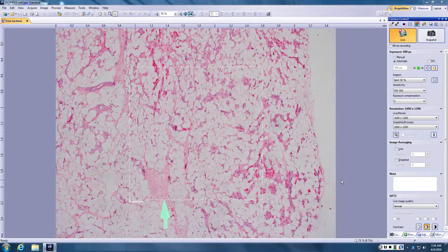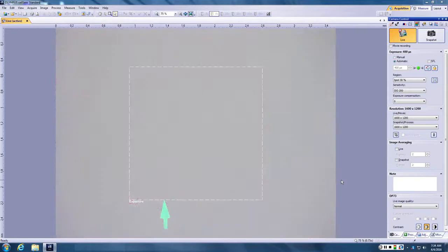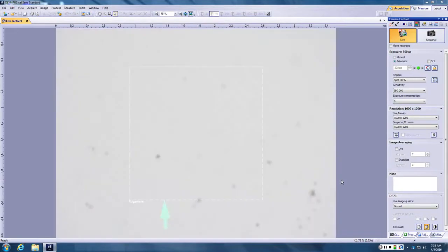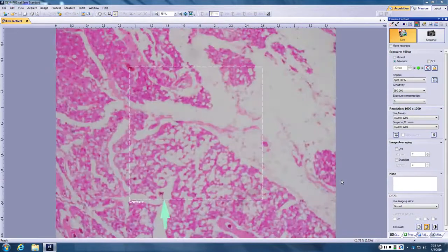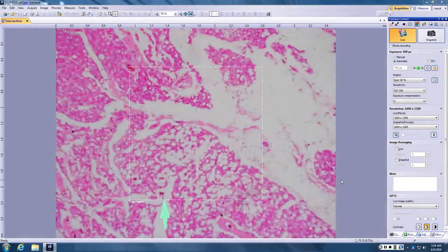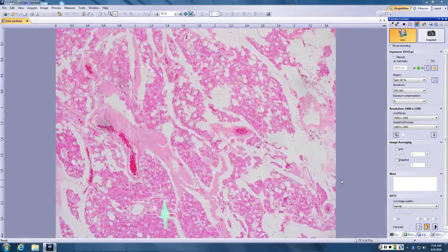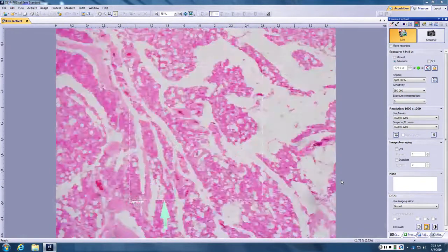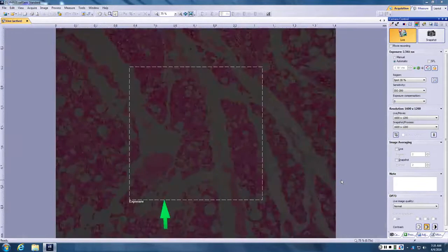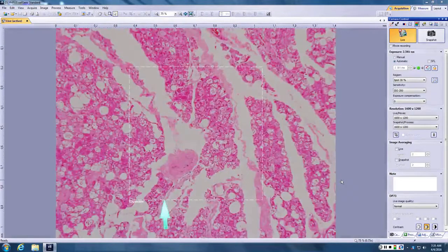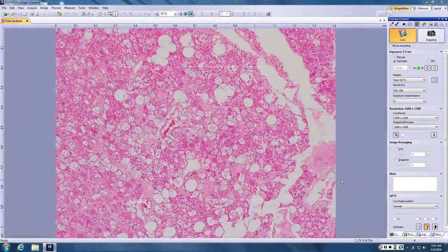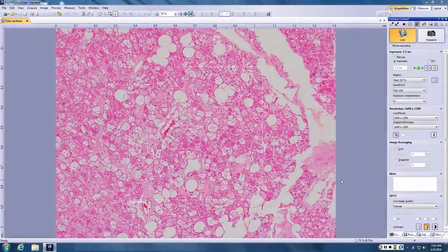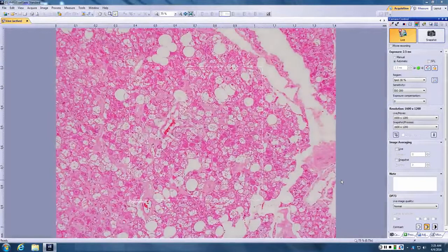I remember the one that had the ropey is like the key thing there. Pleomorphic? Bronzing? Well, or spindle cell. Spindle cell lipoma. So fat, ropey collagen and myxoid connective tissue are key for that.